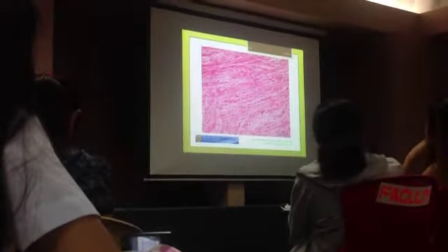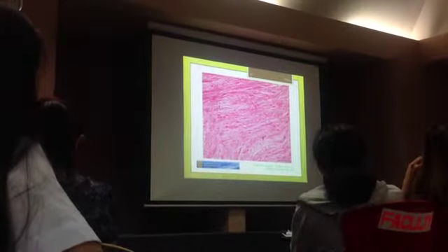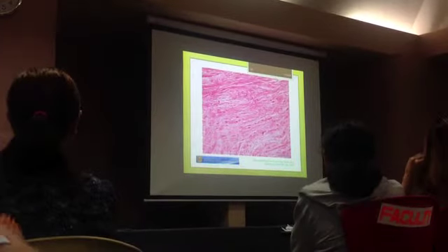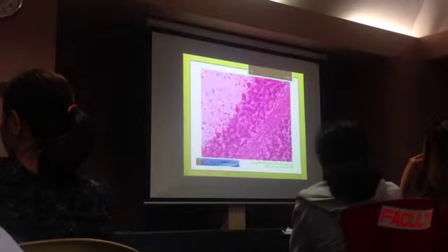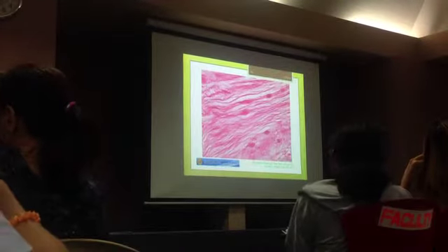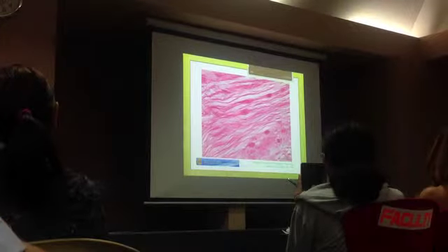Classify pointed tissue, be specific. This is high power.